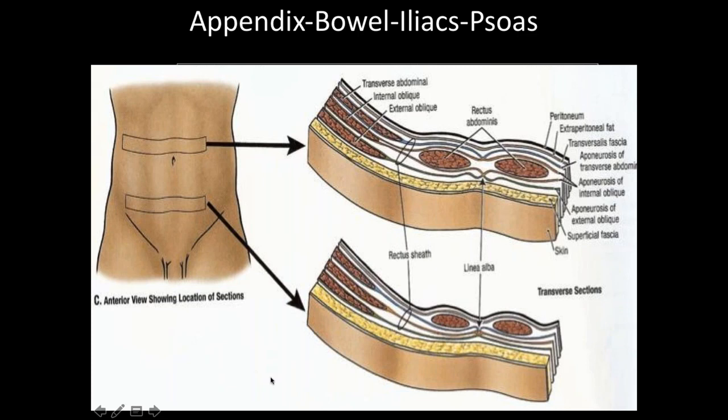It's going to be skin, so the ultrasound is going to be right here, and it's going to be shooting down an ultrasound beam right through the abdominal wall into intraperitoneal content right here. So as the ultrasound beam is cutting through, it's going to go through skin, subcutaneous tissue, and then a layer of muscle. There are actually 3 layers here. It's going to be the external and internal obliques, the transverse abdominis, and then finally it's going to be the peritoneal lining here. And then deep to that peritoneal lining, you'll end up seeing bowel.